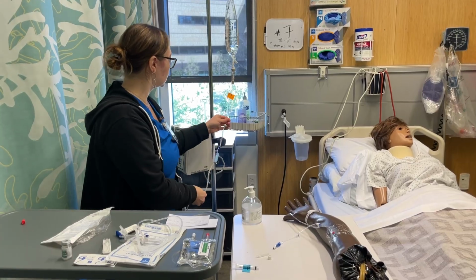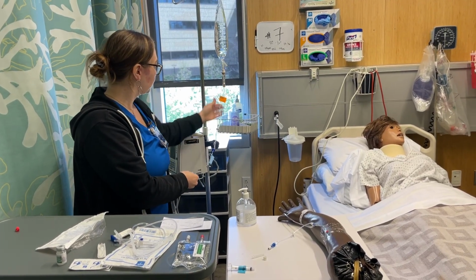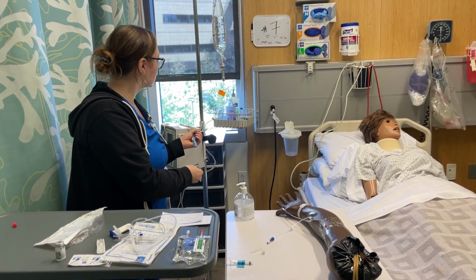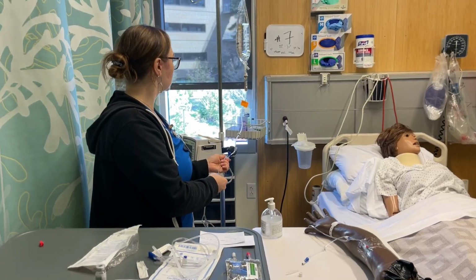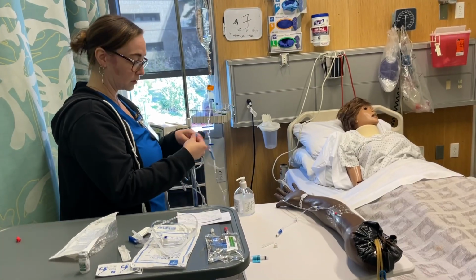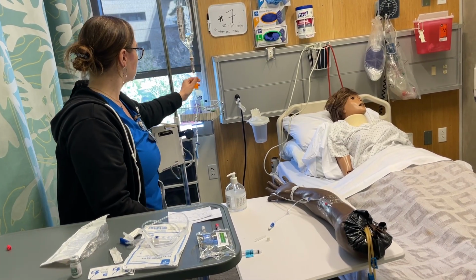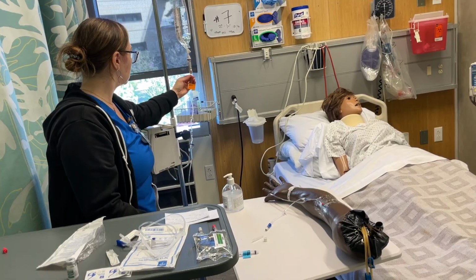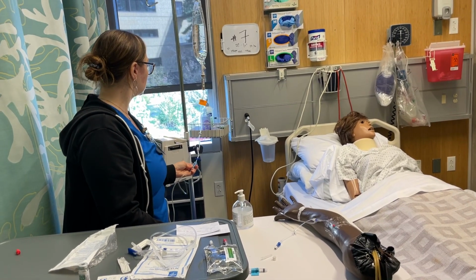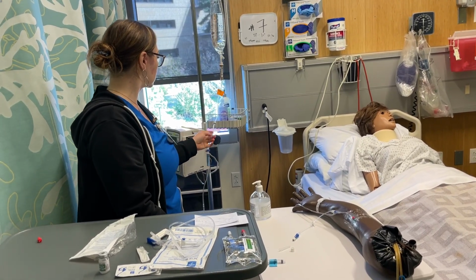The tubing is kinked. Okay, so this should be dripping and it's not. Everything's unlocked and open, so.